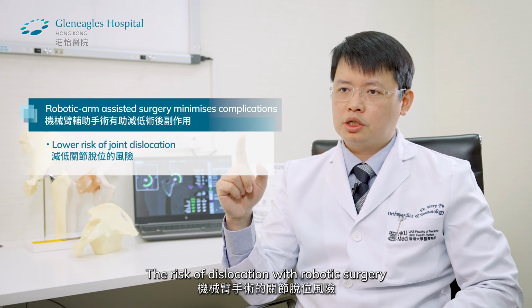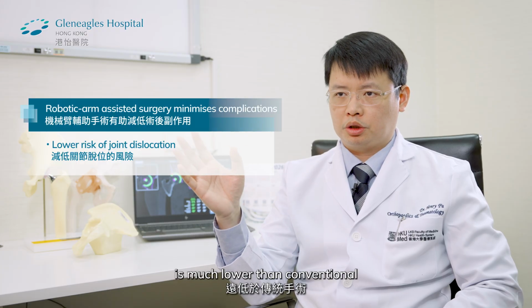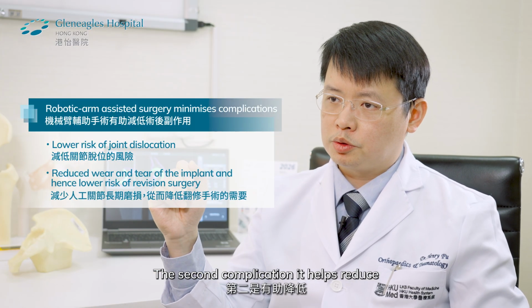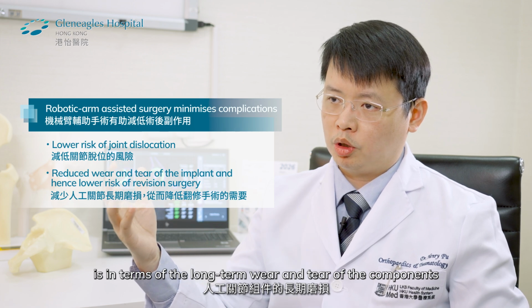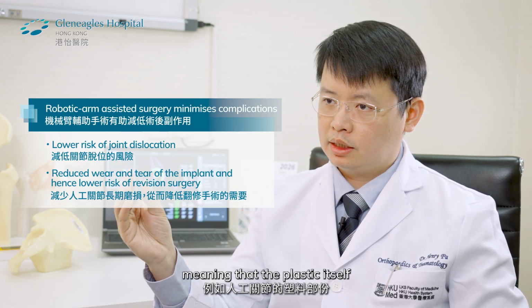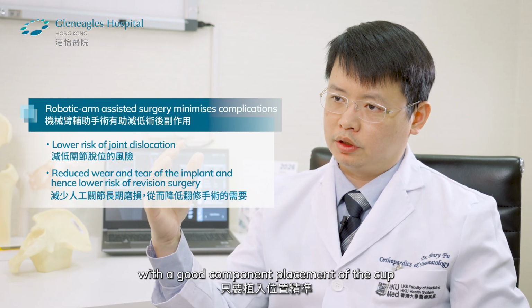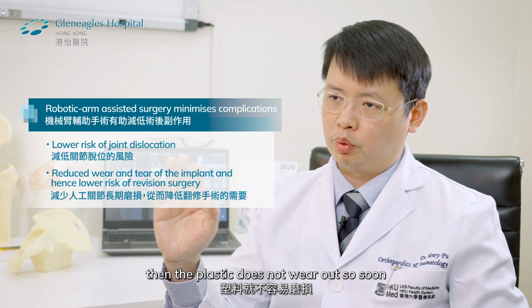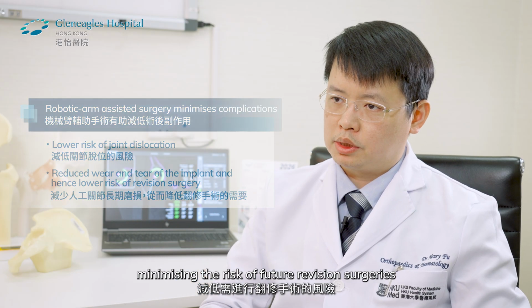The risk of dislocation with robotic surgery is much lower than conventional. The second complication it helps reduce is the long-term wear and tear of the components, meaning that with a good component placement of the cup, the plastic does not wear out so soon. So minimizing the risk of future revision surgeries.